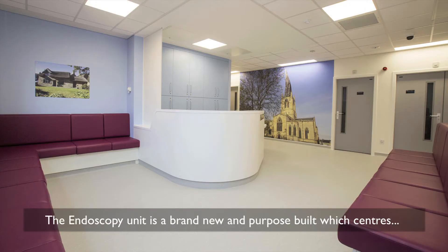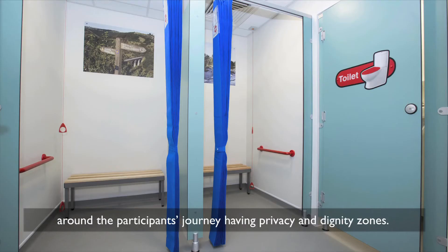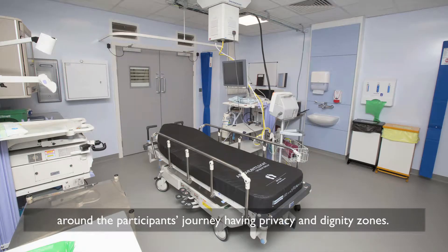The endoscopy unit is brand new and purpose built, which centres around the participant's journey, having privacy and dignity zones.